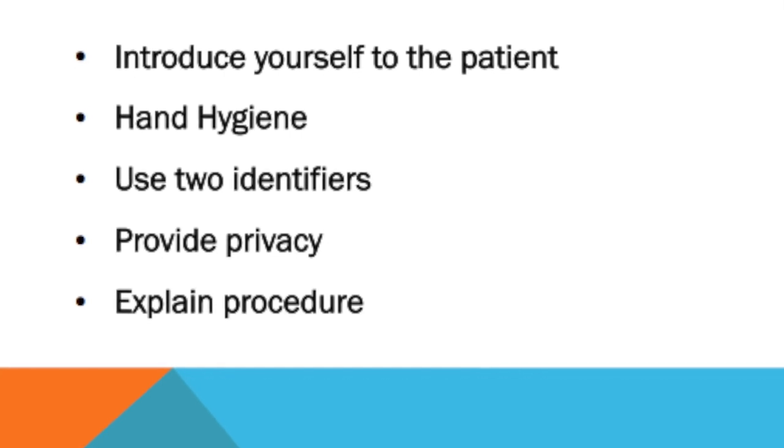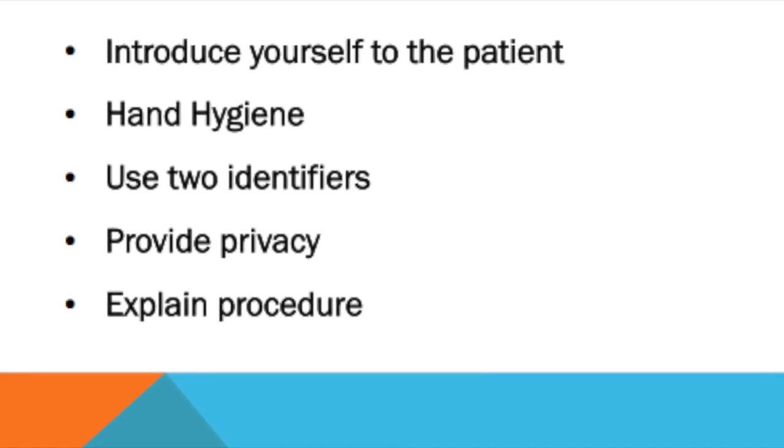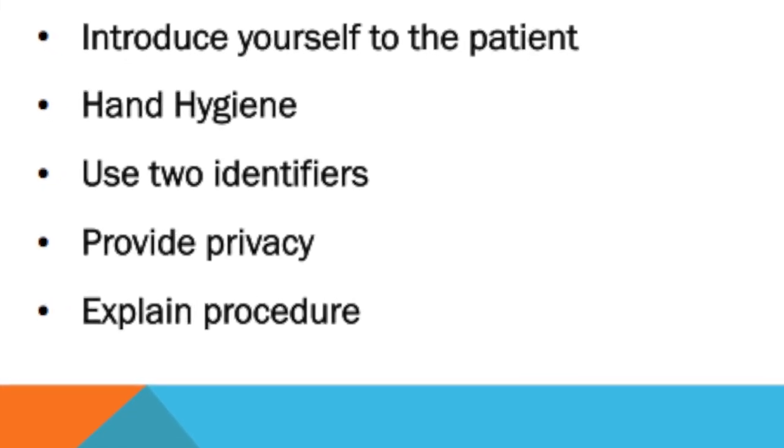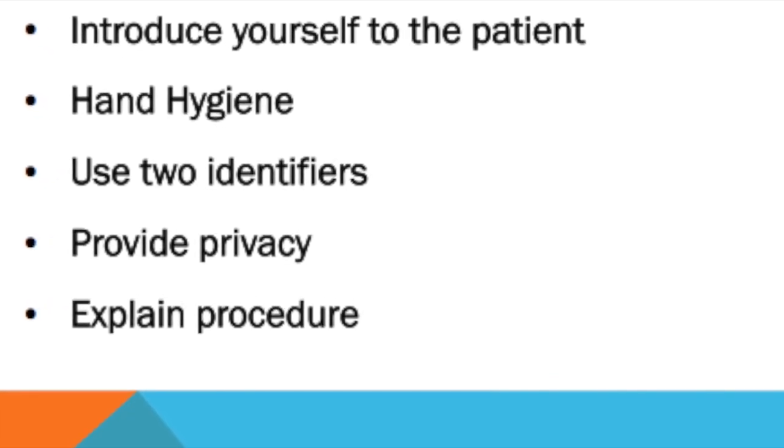As with any time you are entering a patient's room, introduce yourself to the patient, perform hand hygiene, use 2 identifiers to identify your patient, provide privacy, and explain the procedure.